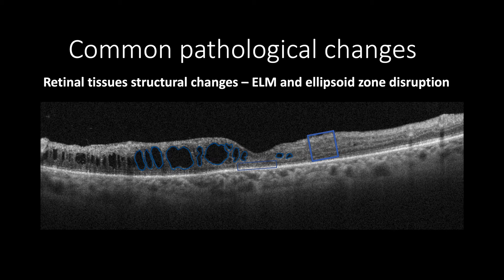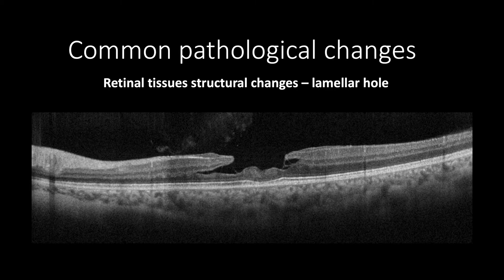As intra-retinal cysts enlarge in size and collapse with or without vitreomacular traction, evulsion of inner retinal tissue may occur. Evulsion of the cystic roof will cause a lamellar hole, leaving the retinal surface with a lamellar defect of inner retinal tissues.